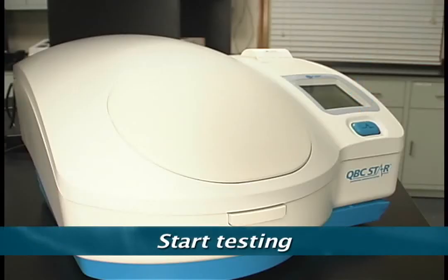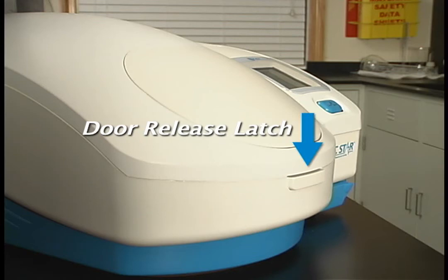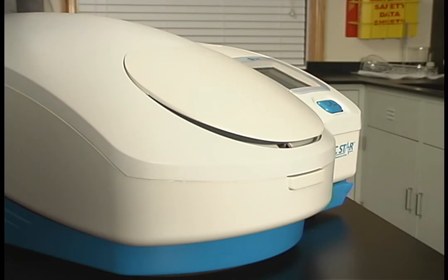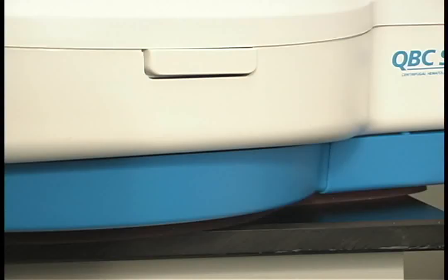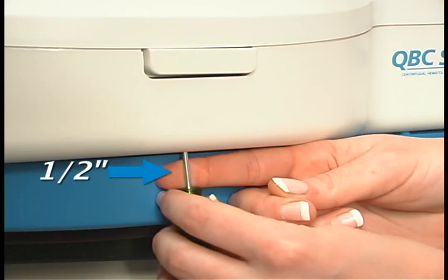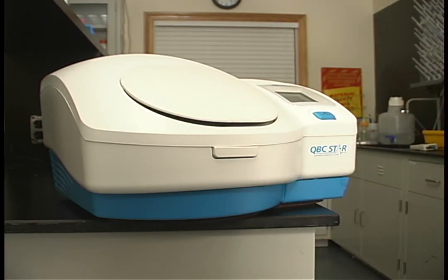Below the display screen is the blue STAR button. The STAR button is used to start testing, to abort testing, or to reprint results. The door release latch is located on the front panel of the instrument right below the door. Pressing this button will pop open the sample door on top of the STAR. The door can only be opened when the STAR determines that it is safe to do so. The STAR also has an emergency door release should a power failure occur and you need to open the door manually. The release is located below the door release latch on the underside of the unit. Insert the green handled screwdriver that was shipped with the unit into the hole, allowing approximately one half inch of the screwdriver shaft sticking out. Pull the green handle toward you — applying a small amount of pressure to the screwdriver will unlatch the door.